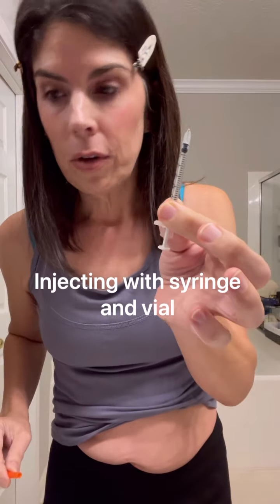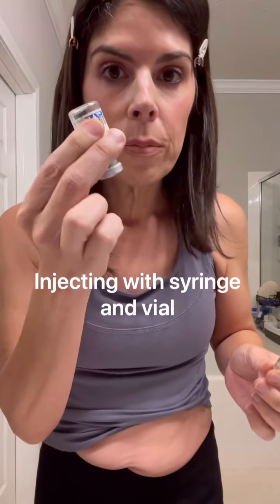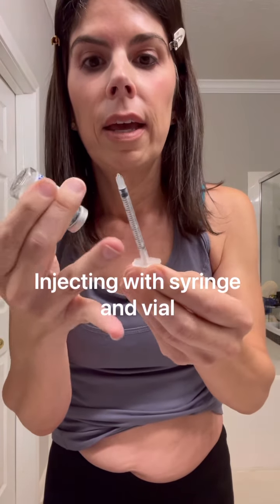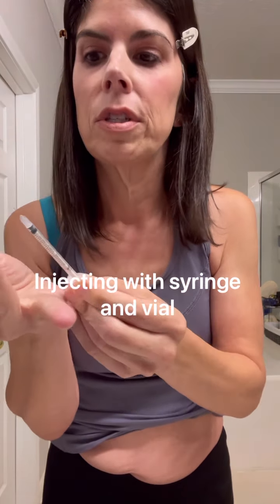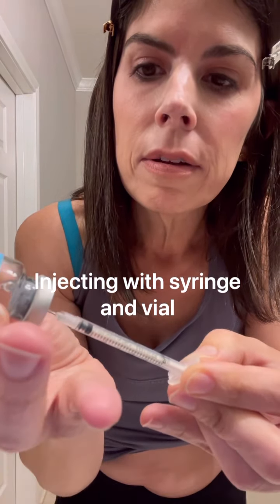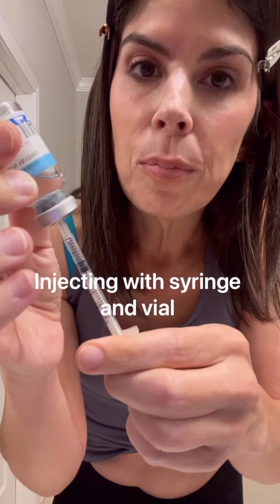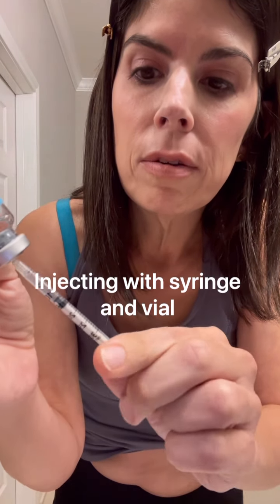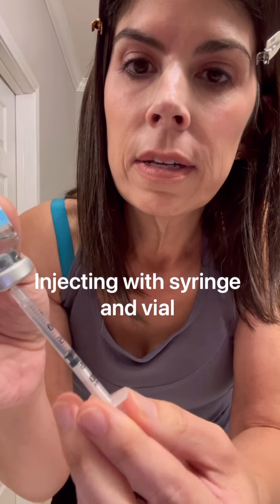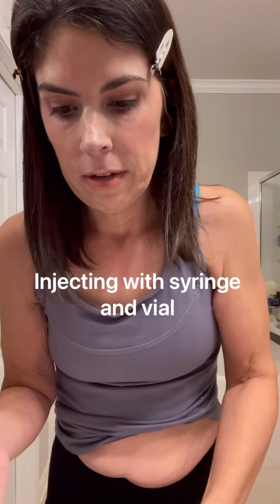Now you have an open needle. Take your vial, flip it upside down, and insert the needle — don't let your fingers touch the vial opening or the needle, for sanitary reasons. Since you've primed the needle, pull back the plunger to draw up the amount you need, then remove the needle from the vial.